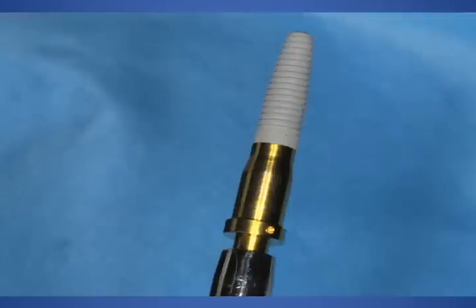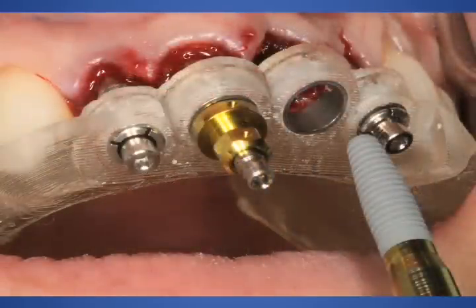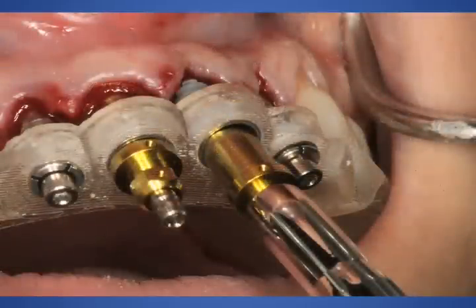Now we're taking our 4.3 millimeter Replace implant, again with a 10 millimeter long surgical abutment that will be used to thread the implant through the surgical rings into the osteotomy site. Again, the small little dots are facing towards the facial, which indicates that one of the 3 lobes with this system is facing towards the facial. Here we're doing the same with tooth number 9.